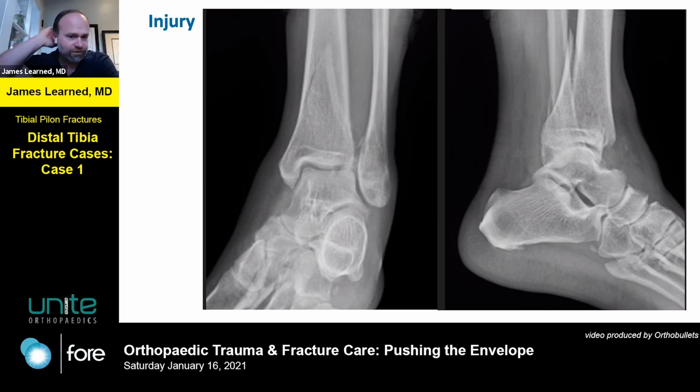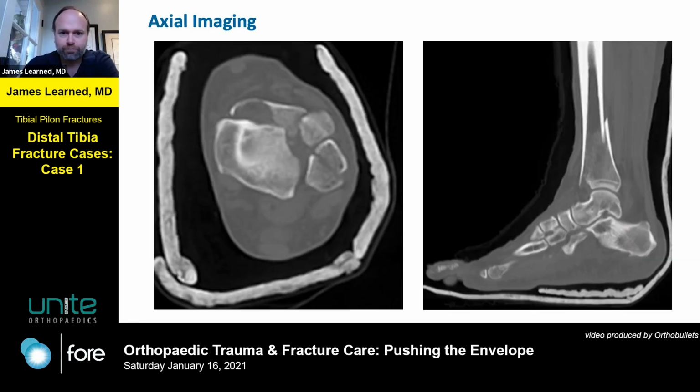And then as far as timing for surgery, if there is a significant soft tissue injury, that can really help maintain your length and alignment so that when you return to the operating room for your definitive management, you're not fighting a bunch of shortened, scarred soft tissue. So when in doubt, span it out. In this case, we got a CT scan and a splint. We see a nicely placed splint with a good neutral ankle position on the sagittal reconstruction there.